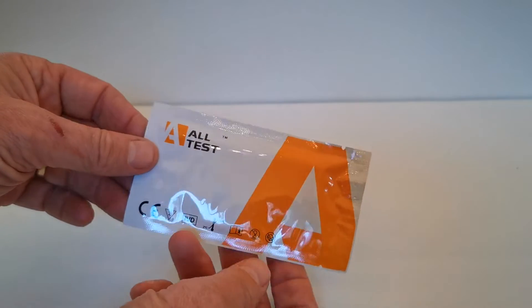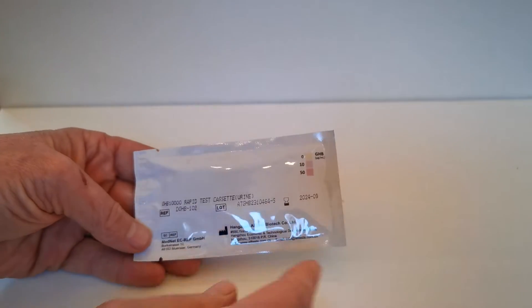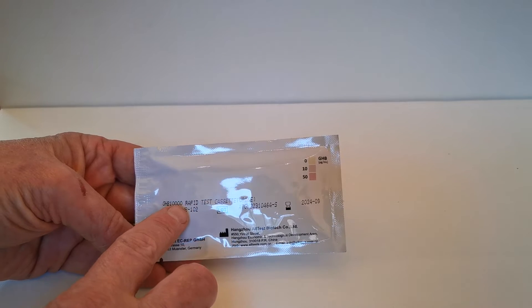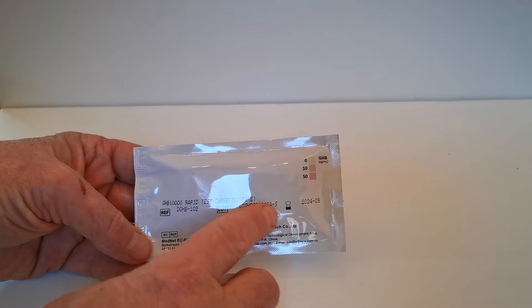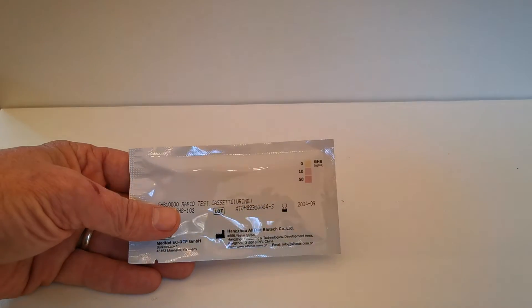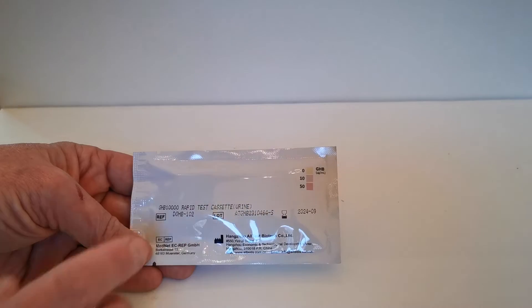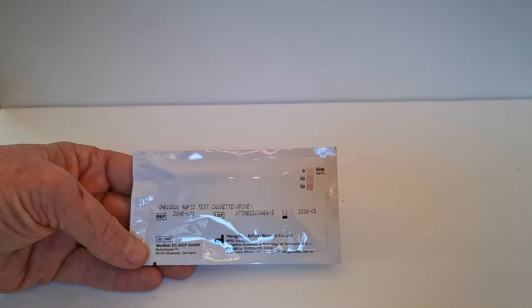This is the foil standard all-test CE marked graphics on the front and on the rear. We've got a GHB coding with lot number and expiry. This is the interesting part: you need to retain the foil, as it's a semi-quantitative indicator of the concentration of GHB in the sample.